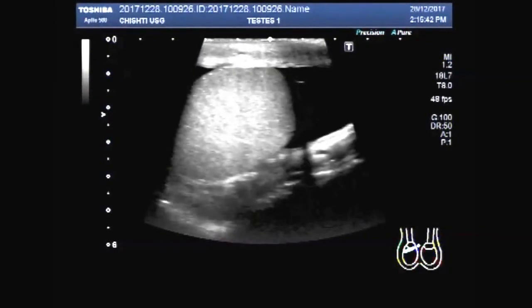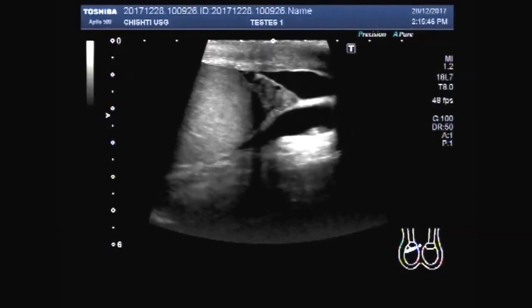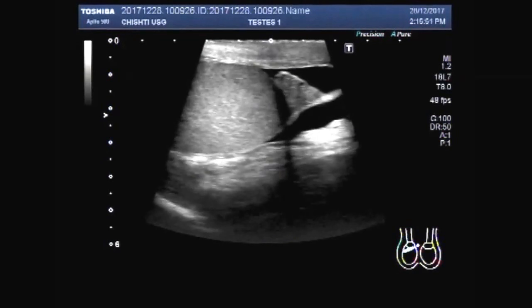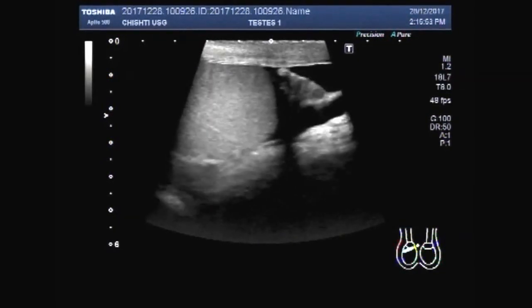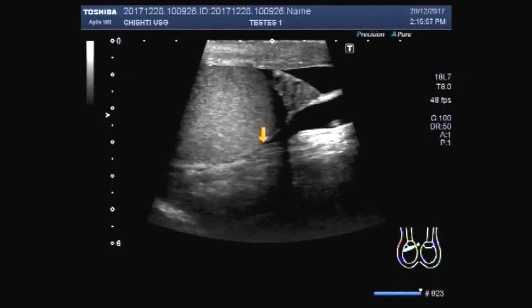That is no pyocele. You can see the fluid inside the scrotum, and this is the head of the epididymis.